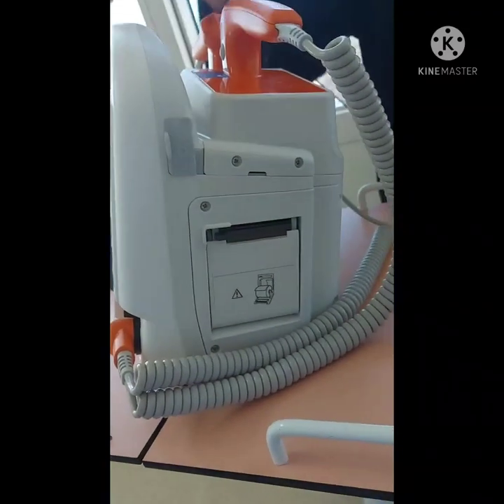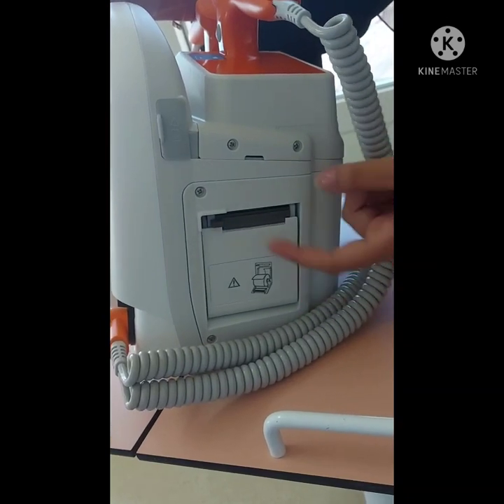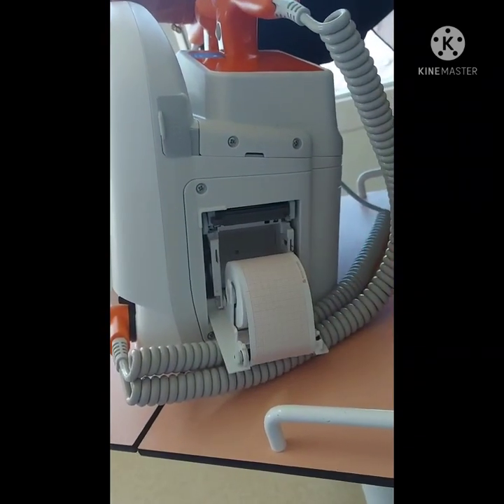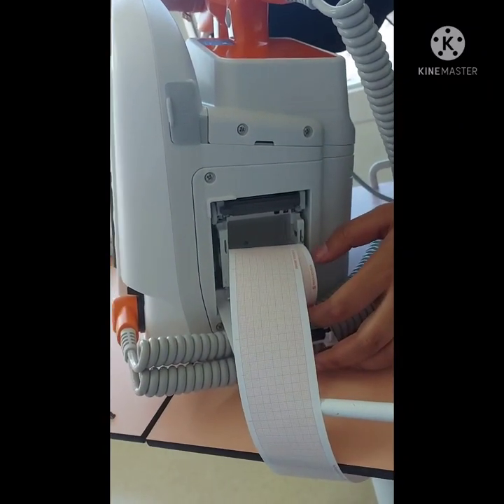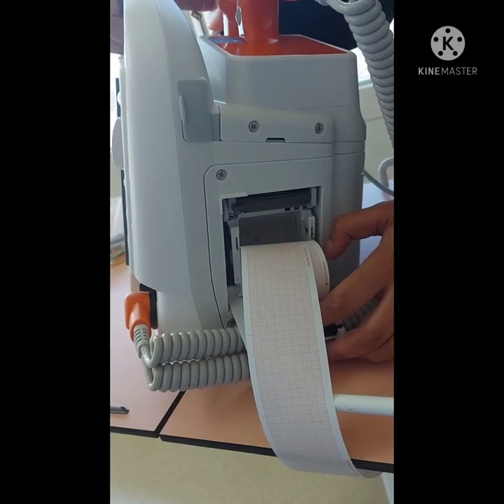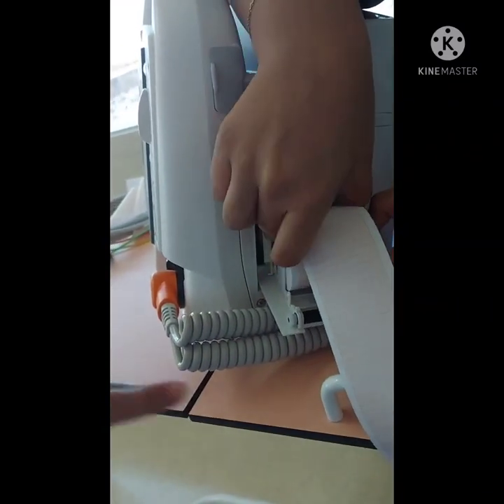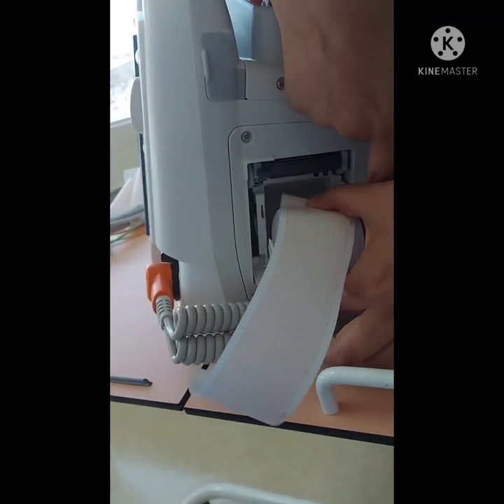Here you have the recorder compartment. If you want to open it, you just have to pull up. Then you can see this is the paper, the same that we are using. I don't know the paper size you have. The same size, maybe. Otherwise you have to request a new one. It already comes with, I think, three rolls of paper.